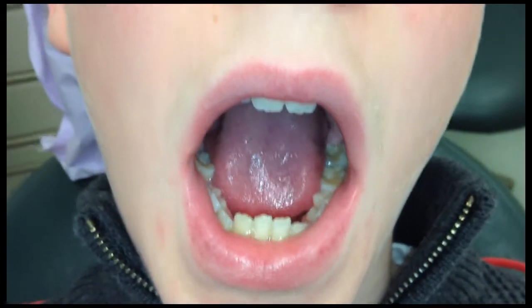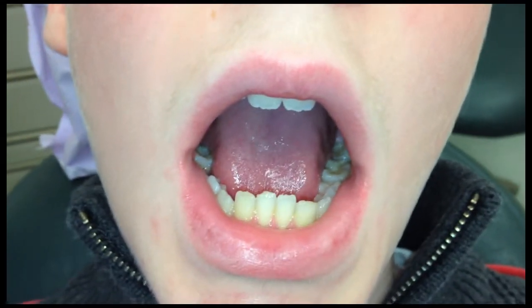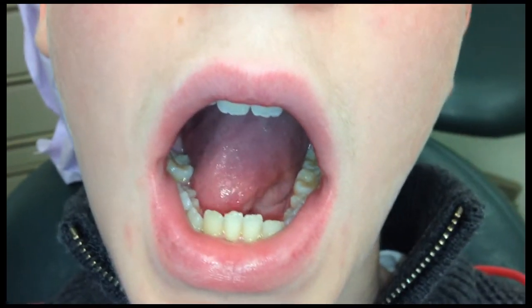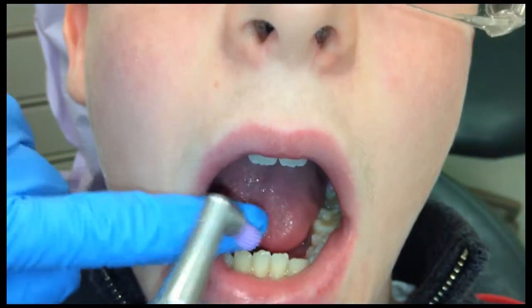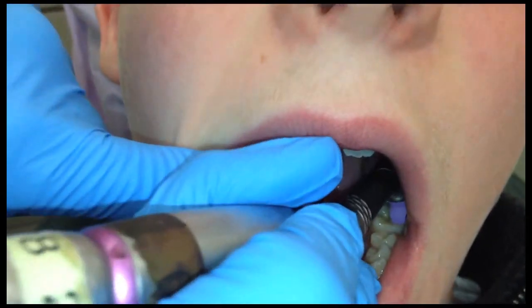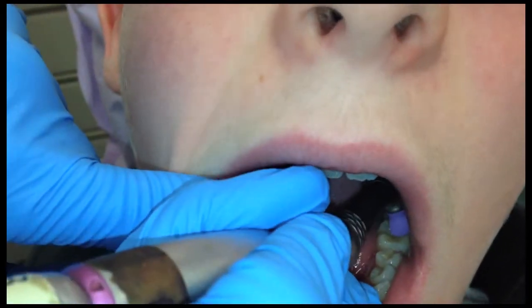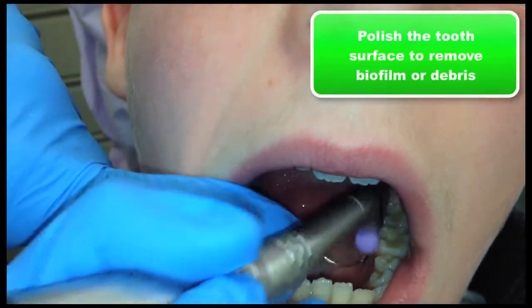This is a step-by-step instructional video on sealant placement. The first step is to prepare the tooth surface to receive the sealant. This is accomplished by polishing the occlusal surface with either pumice or hydrogen peroxide. In this video, we will be using pumice. Remember, a clean surface is necessary to ensure successful etching.